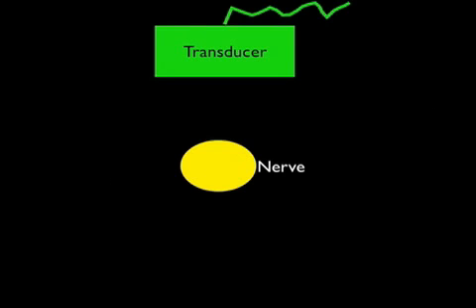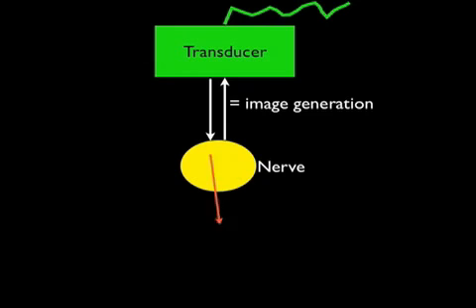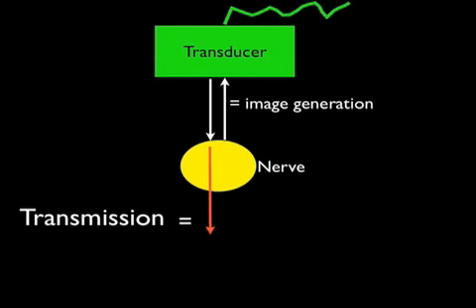The objective of an ultrasound scan is to optimize the amount of ultrasound that actually reflects off of an object and returns to the transducer. This is not always possible, however. Some ultrasound will always travel through an object, known as transmission. Some ultrasound will change its direction as it passes through an object. This is known as refraction. It should be noted that refraction is a source of artifact generation. This will be covered in a later video series.